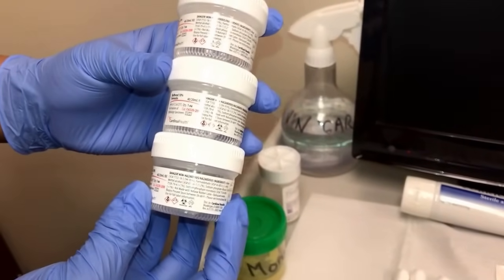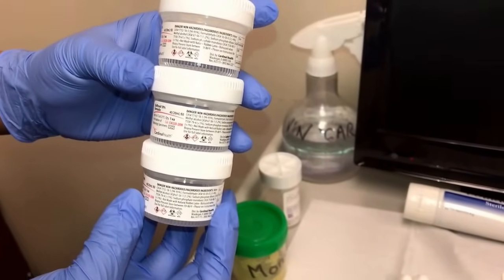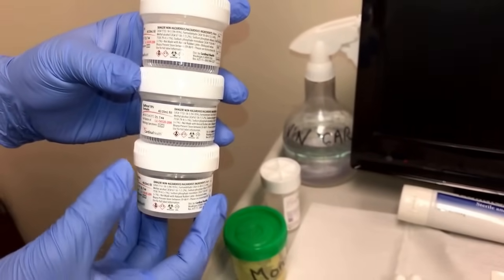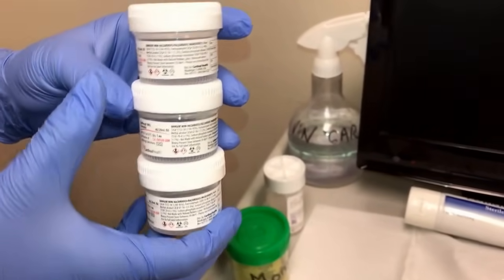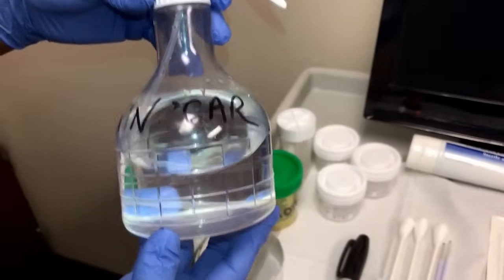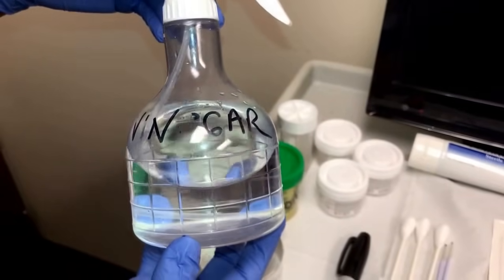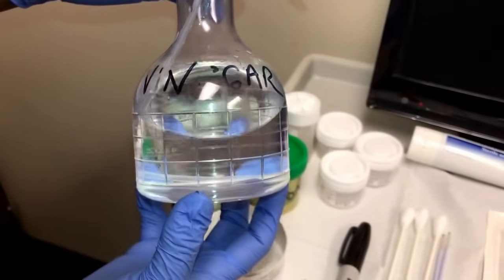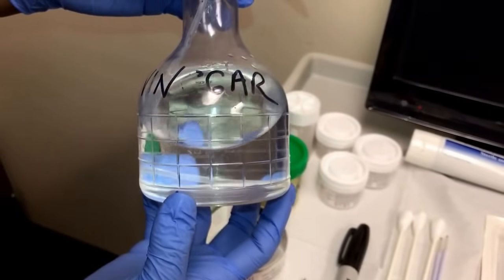These vials are for the biopsies taken by the provider. It is up to the provider whether they want all the biopsies in one container or separated individually. This vinegar solution is used by the provider to highlight any areas of concern, which will then be biopsied by the provider.